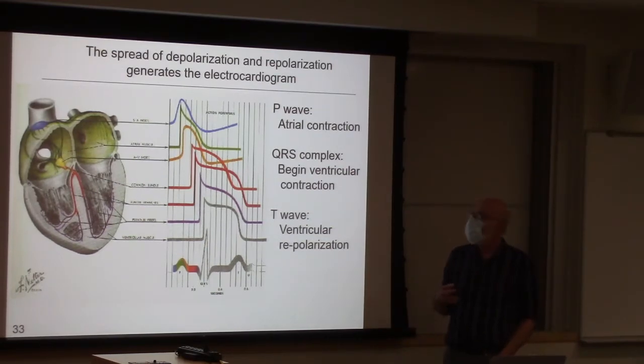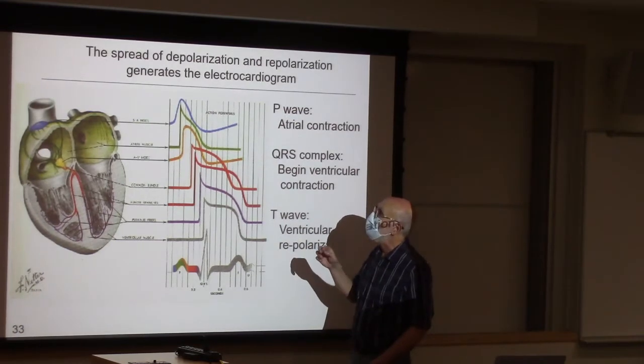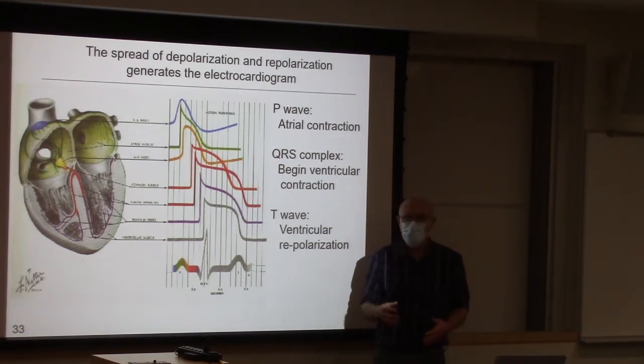As a way to start, let's just remember the path of electrical information. Remember, we're talking about electrical information, not pressure or contraction here, because the ECG is recording electrical information.